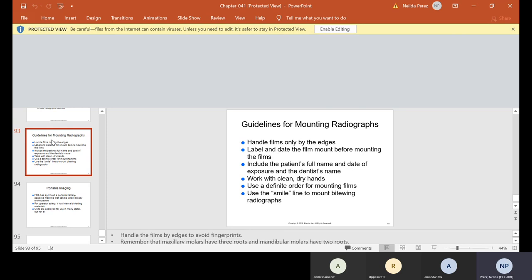Guidelines for mounting: handle films only by the edges. Label and date the film mount before mounting — include the patient's full name, date of exposure, and dentist's name. Work with clean, dry hands. Use a definite order for mounting films. Use the smile line to mount bite wing radiographs. It is critical to know how the dentist prefers to have radiographs mounted. I usually mount bite wings first so I can use them to help mount the top and bottom — for beginners especially, try to use that order. It's like a puzzle — you're going to match the teeth to that puzzle.